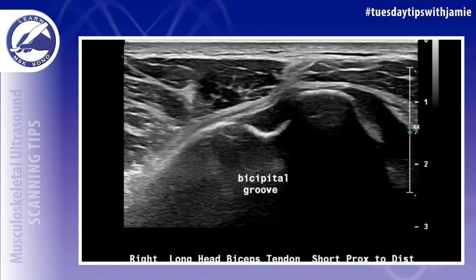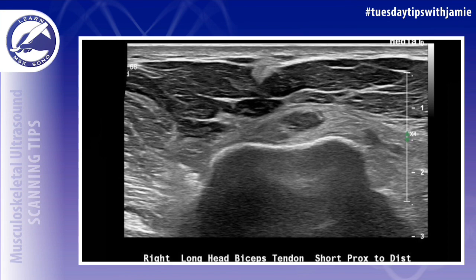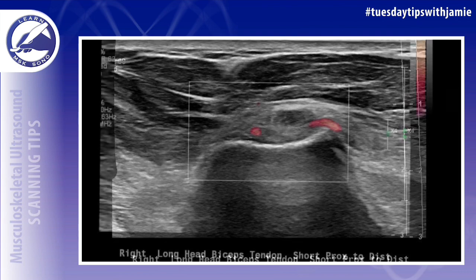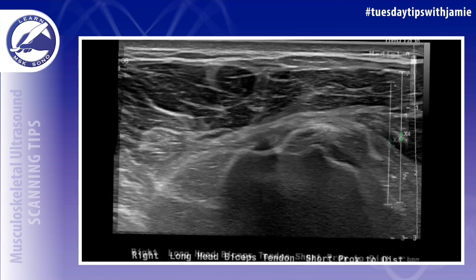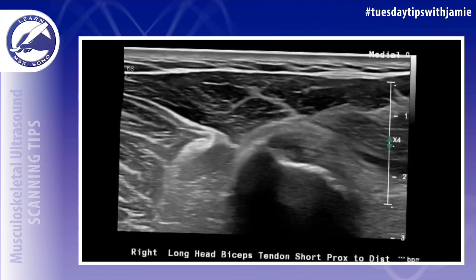What images should you take if you don't see the long head of the biceps tendon inside the bicipital groove on your MSK ultrasound exam of the shoulder when a biceps tendon rupture is suspected? The following ultrasound images should be obtained when the long head of the biceps tendon is ruptured and is no longer visualized: take multiple consecutive images of the area where the biceps tendon typically runs through the bicipital groove in the short and the long axis from proximal to distal.